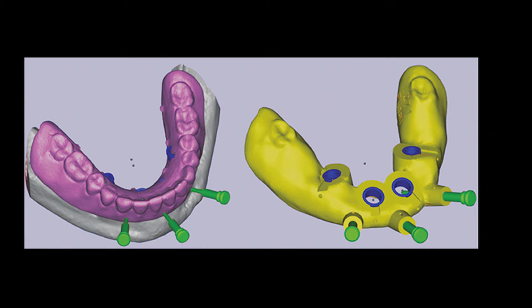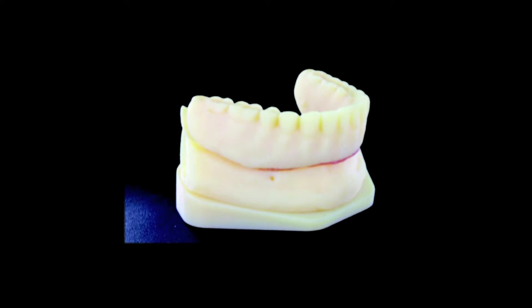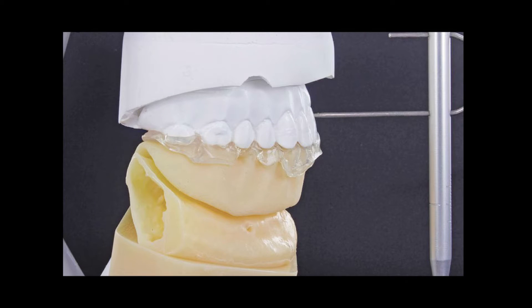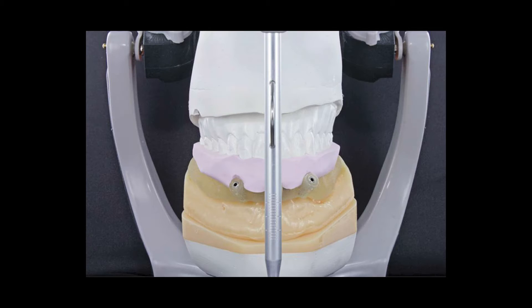The provisional prosthesis and surgical guide were designed using the occlusal and intaglio surface data from the scan appliance. After segmenting the DICOM data for density, models of the patient's mandibular arch, provisional denture, and surgical guide were 3D printed and then articulated so the entire surgical and prosthetic stack could be examined. The provisional was designed with relief for the multi-unit temporary cylinders. The surgical guide incorporated occlusal anatomy to function with the bite index for anatomically correct fixation, and a surgical bite index was constructed for precise placement of the guide at the time of surgery.